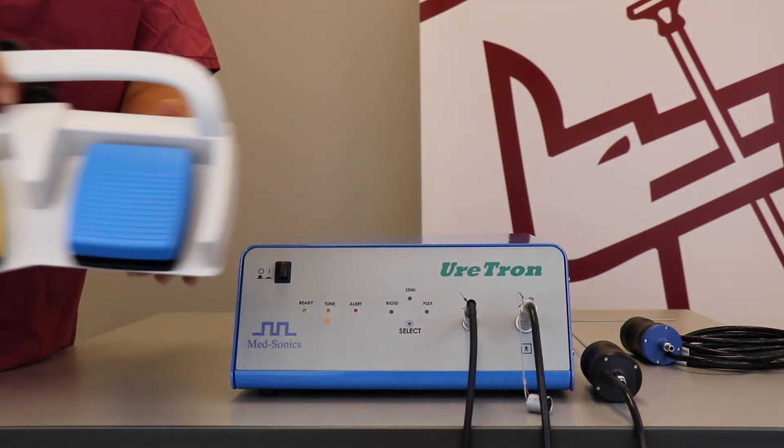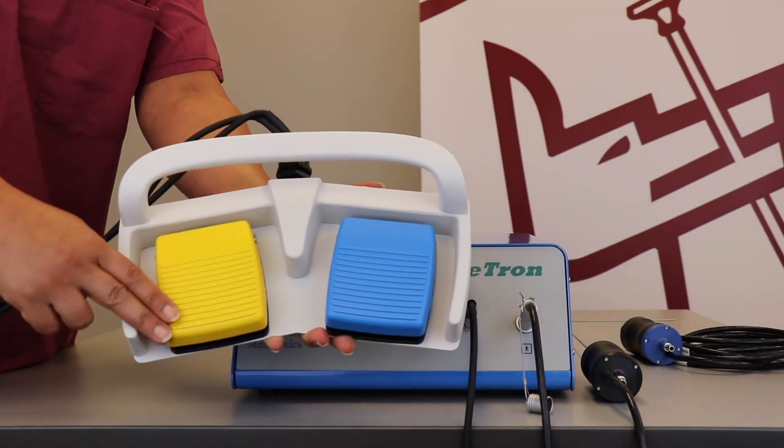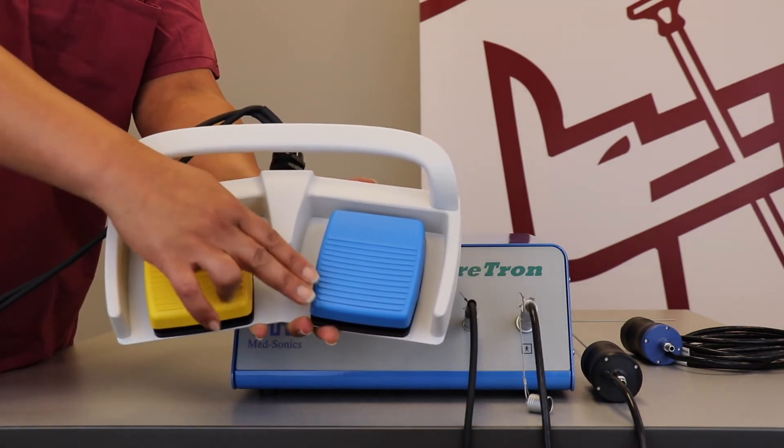The dual foot switch used with the Uratron has two pedals. Yellow is for softer stones. Blue is for harder stones.